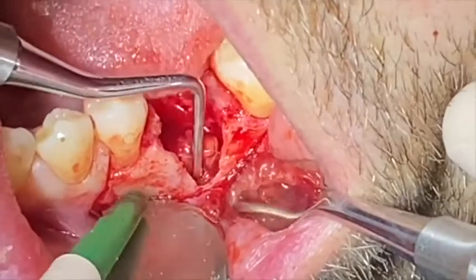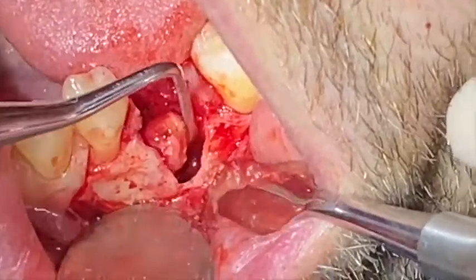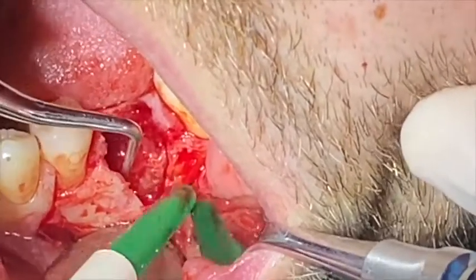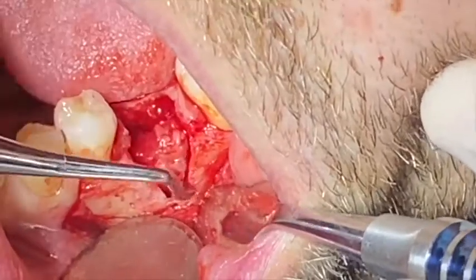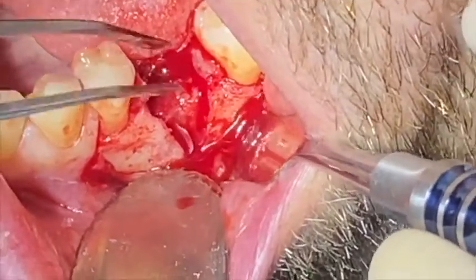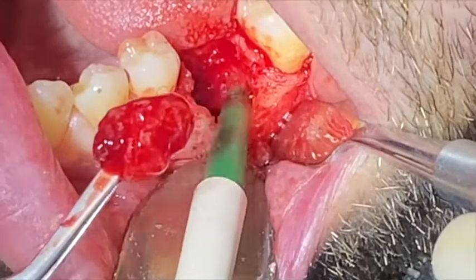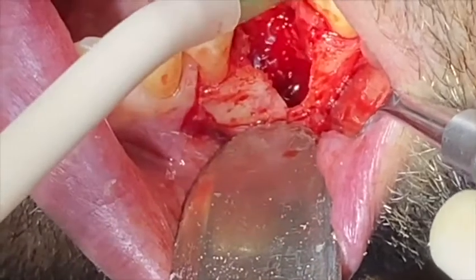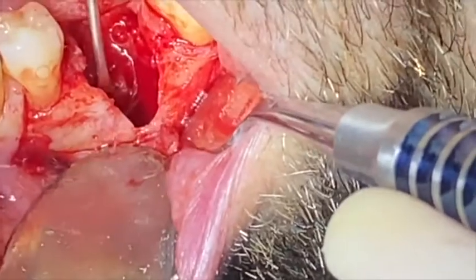Then I'm going to use a curette to remove the cyst. When the cyst is encapsulated, as long as you lean on the bone and touch the bone, you're going to be able to remove that cyst without scratching it. I'm using the bone to connect with the outside of the cyst. In this case it's completely encapsulated. I'm going to remove the cyst, and even though it comes out completely in one piece, I need to make sure that there are no remnants of cyst in the area where I'm going to graft or place my graft.